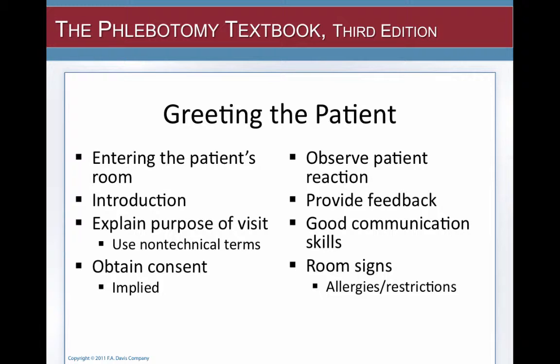You want to explain the purpose of your visit, like I just said. I'm here to draw some blood, but use non-technical terms. Don't go into what types of tests they're going to have drawn. That is not for you to give them that information. That is up to their nursing or their physician staff.